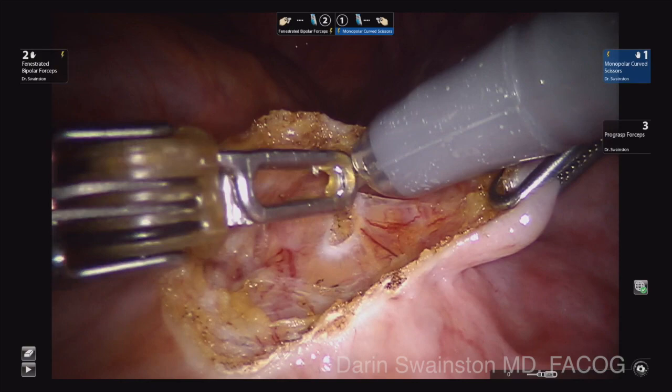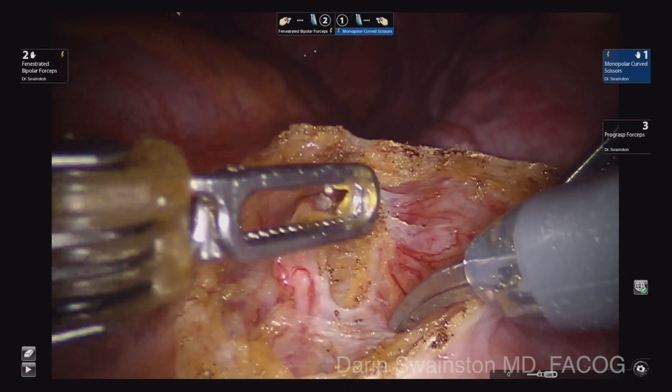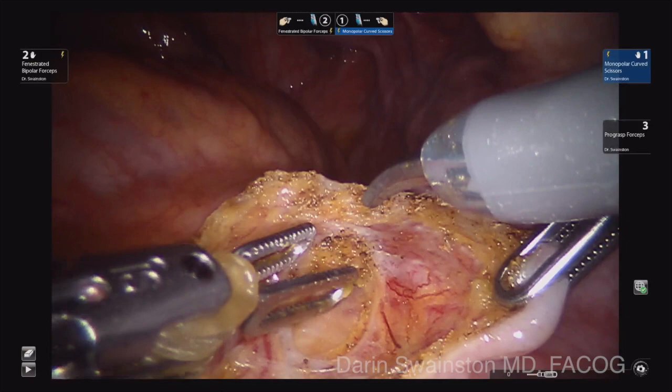I am tapping here. You notice how there is minimal bounce right there. So I am going to open that area up a little bit and go very slow. I am zoomed in and I adjusted the lighting so that I had less reflections so I could see the smaller vessels. Some people would even inject ICG at this point.